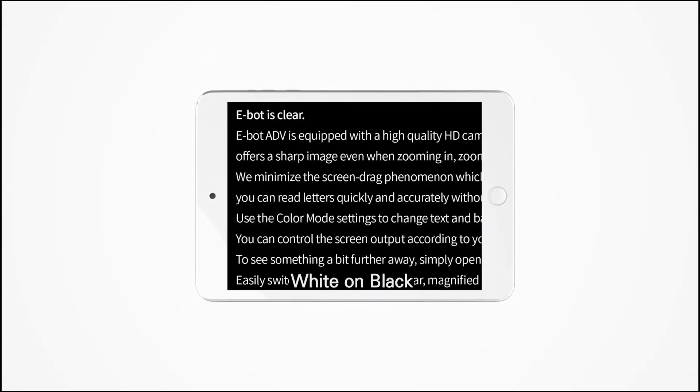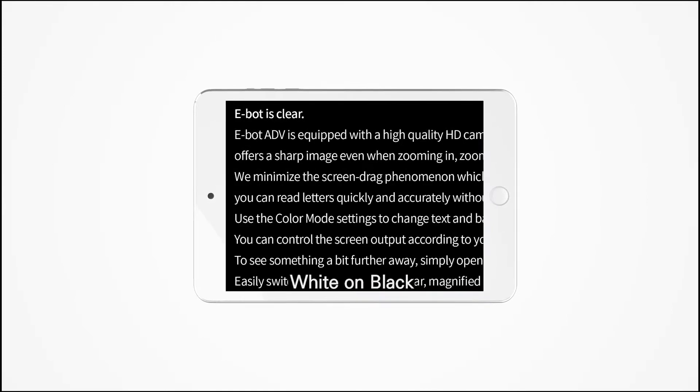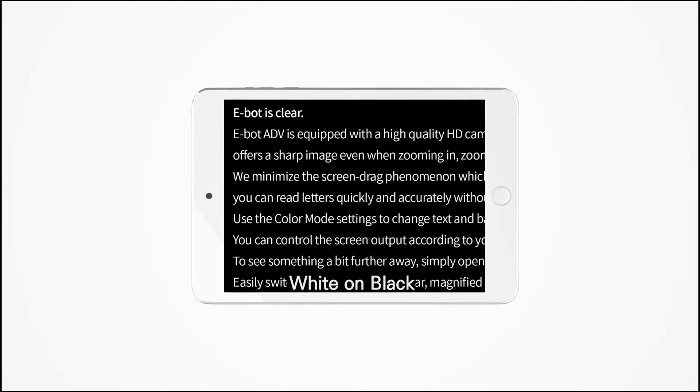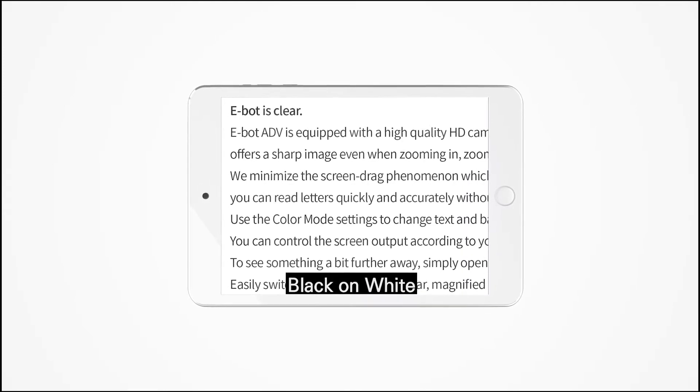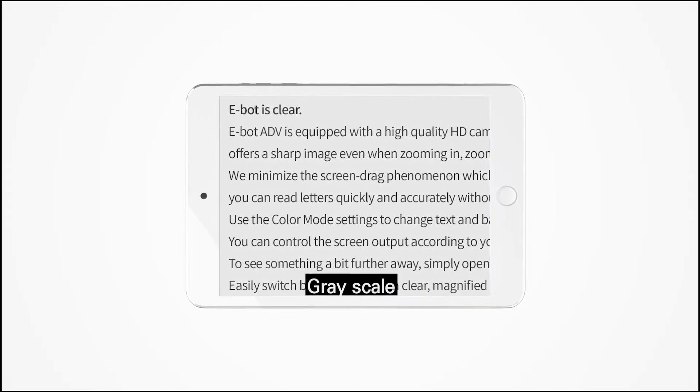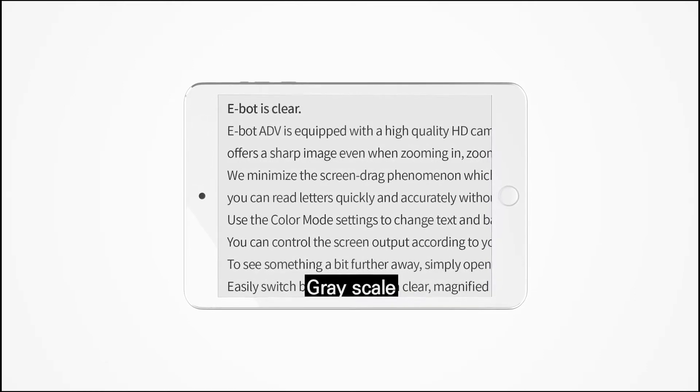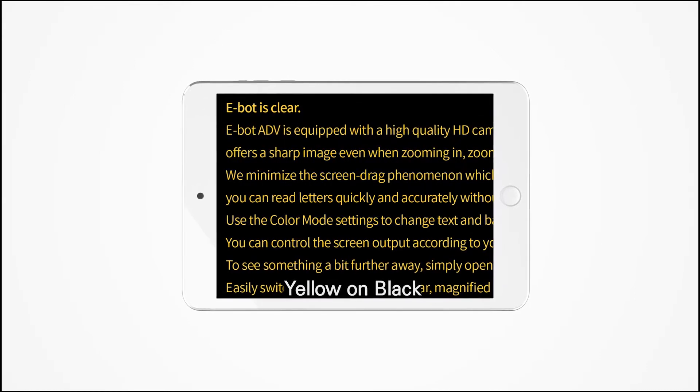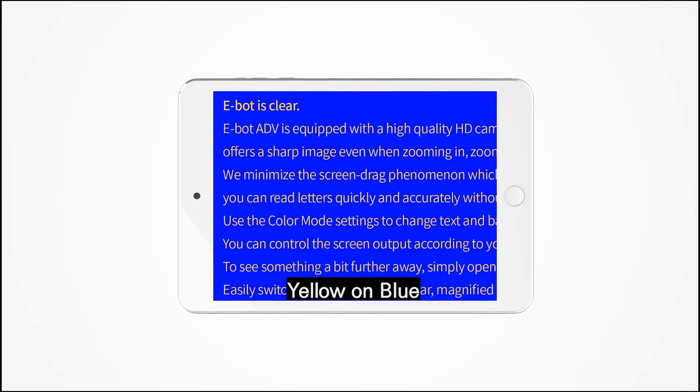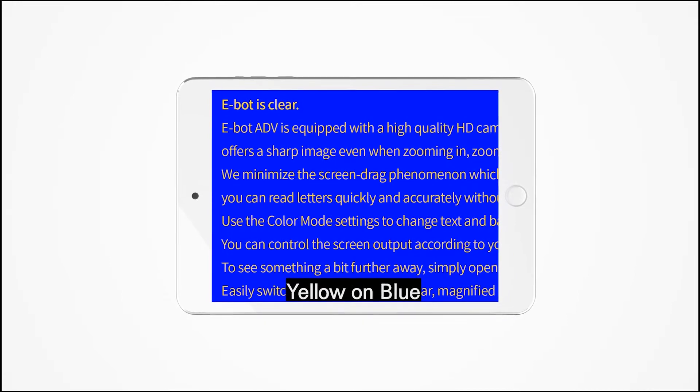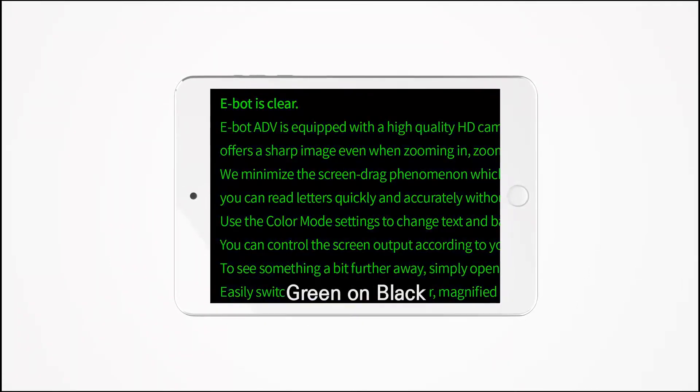Use the color mode settings to change text and background color combinations without sacrificing the quality of the image. You can control the screen output according to your visual needs or condition.